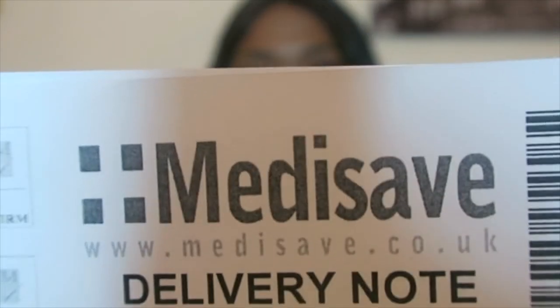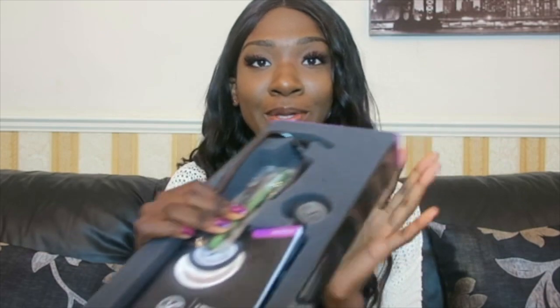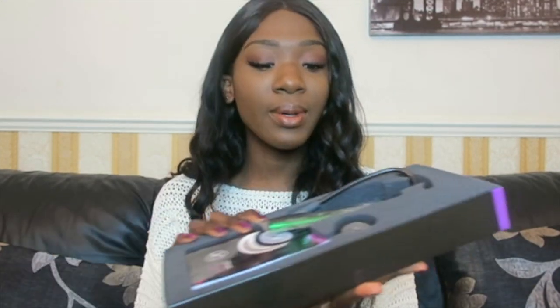Medisave — what I really loved about it is the delivery was quite quick. I got my name engraved and it took about two to three days to arrive, which was really fast. This is how the box looked — it did have Haribos in it as well, which was really cute; they put a little Haribo in for me.